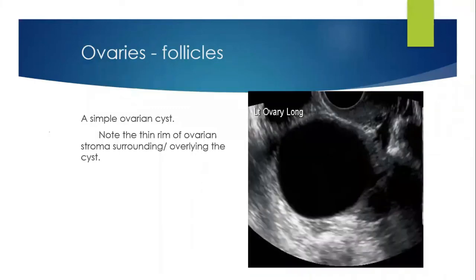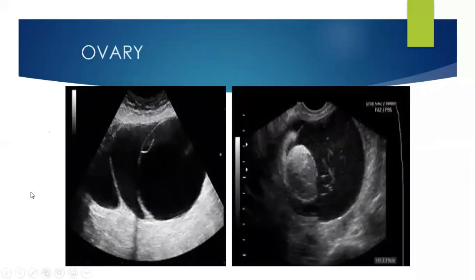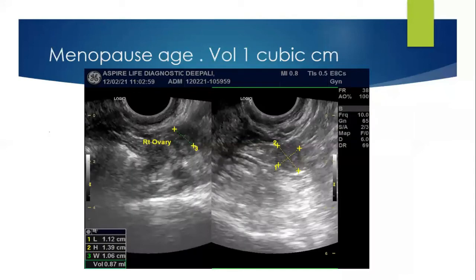Now, suddenly, if a lady has come to you for, let's say, induction on day 2, and in that ovary you see this kind of a follicular structure, that becomes a follicular cyst. We'll be discussing in our next classes, not today, what the follicular cysts are, how to diagnose whether these are hemorrhagic cysts, or a kind of hyperstimulation syndrome, or dermoid, or multiple large follicles seen. Why I am showing you these pictures is that this is how a normal ovary will look. With the help of follicles only, we can identify the ovary, okay?